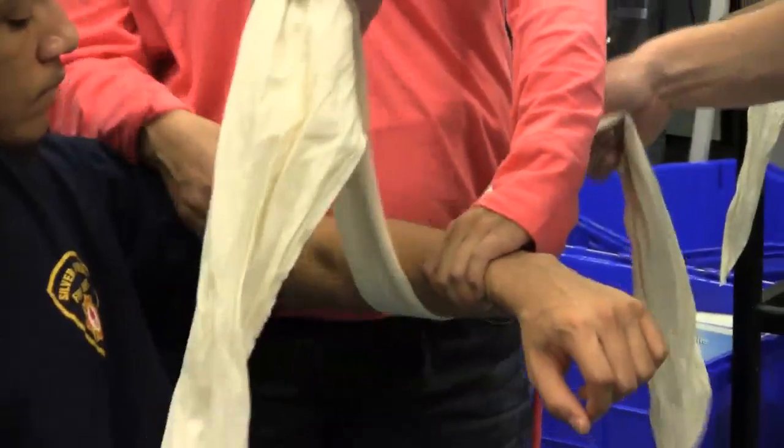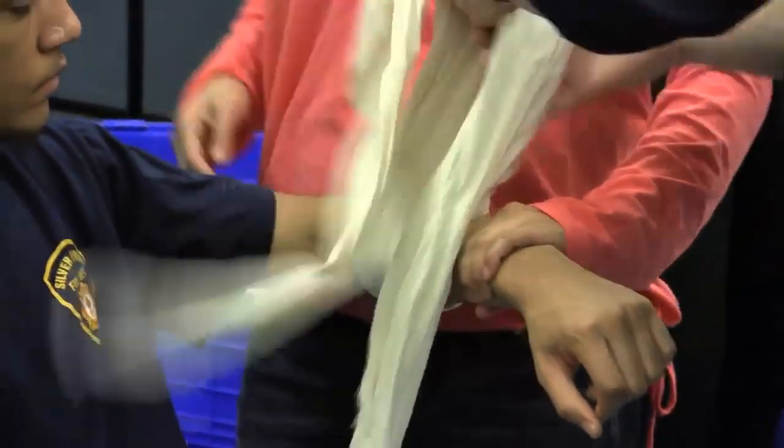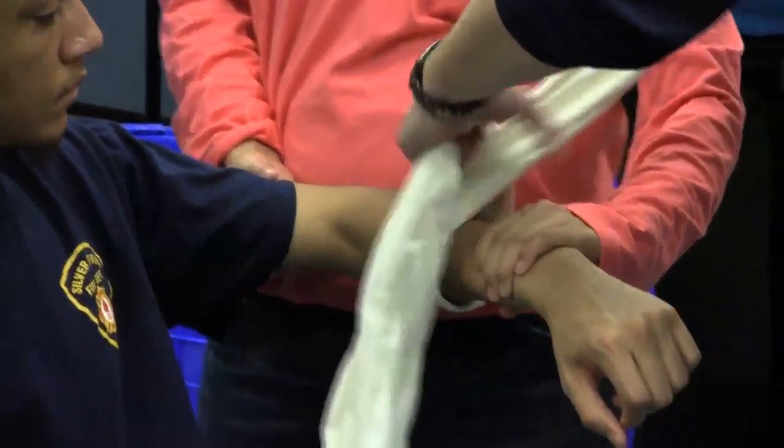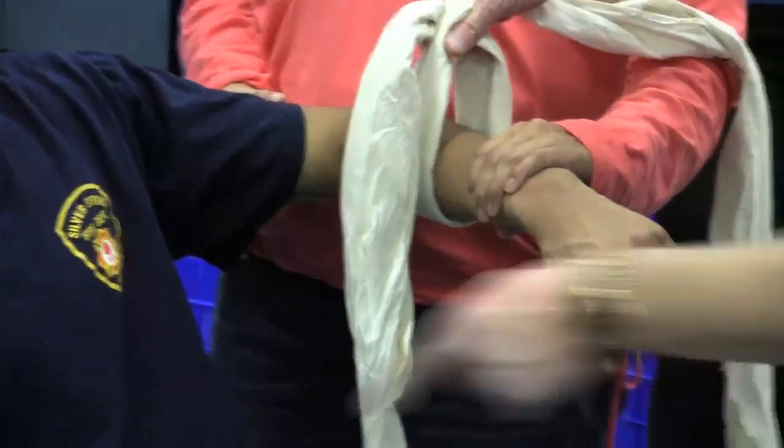How are your tourniquets? They have the service area right here. Get it wide. You want to roll it away — you can roll it away.